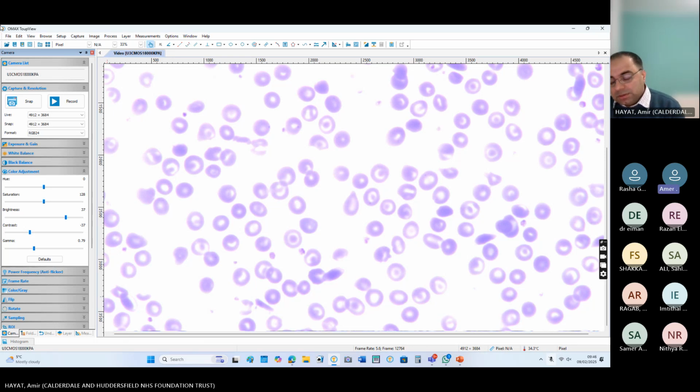It means there is some beta chain activity present. He is not completely homozygous sickle. Because of the beta chain activity, you are seeing microcytosis, some target cells and hypochromia, because the activity is very low but still there.